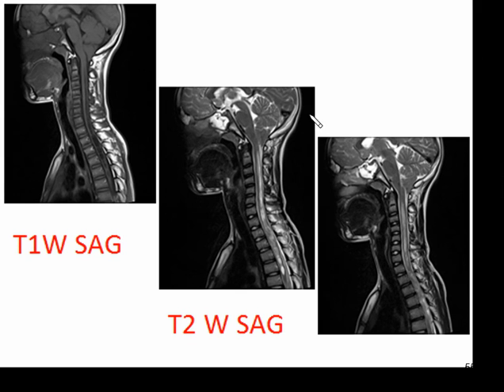Coming to the next case, you can see herniation of the tonsil into the posterior subarachnoid space at the lower cisterna magna with syringohydromyelia. This is a classical case of Chiari malformation type 1 (ACM1).